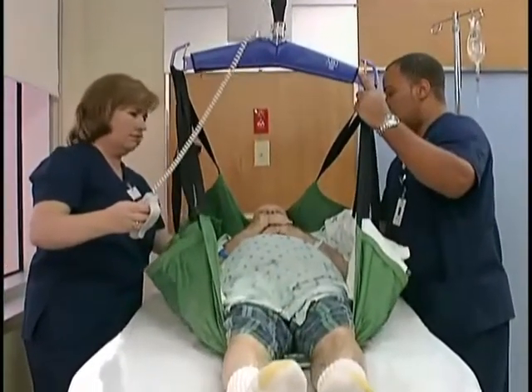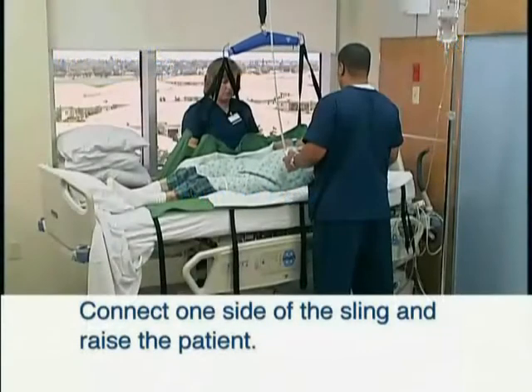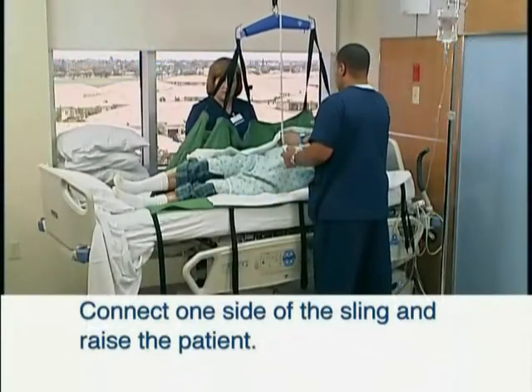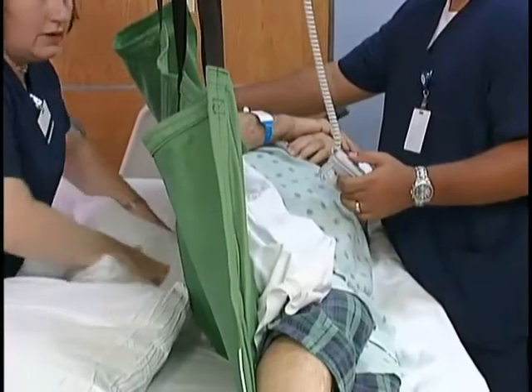Lower the patient. The repositioning sling can also be used to turn patients by connecting one side of the sling and raising the patient. Place a pillow under the patient to maintain the turn position.